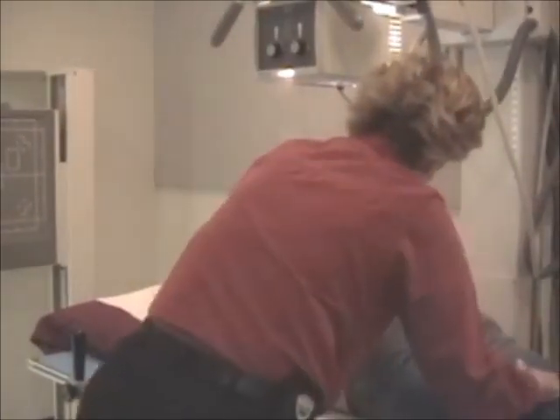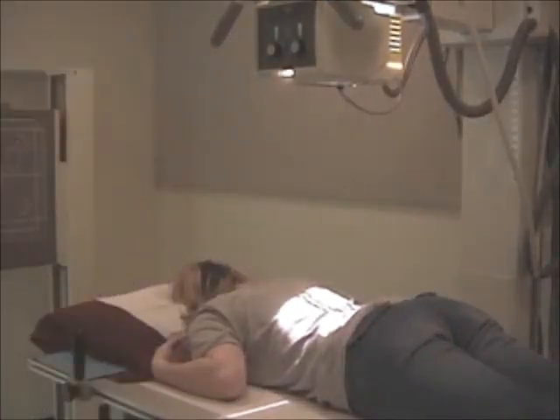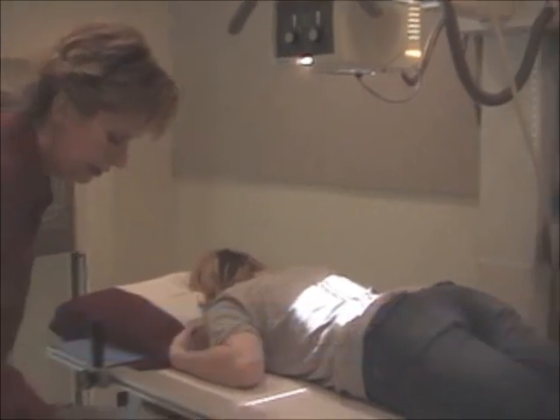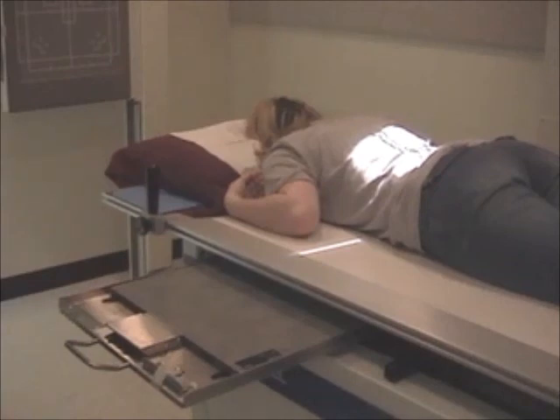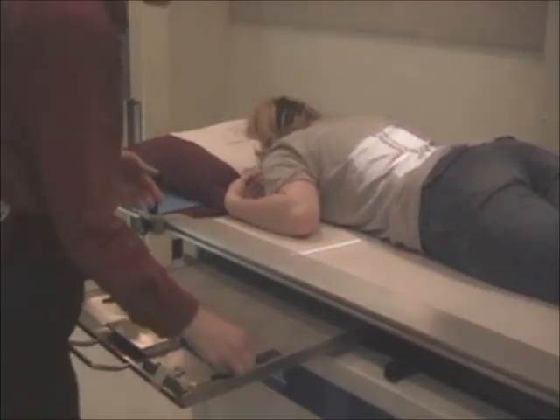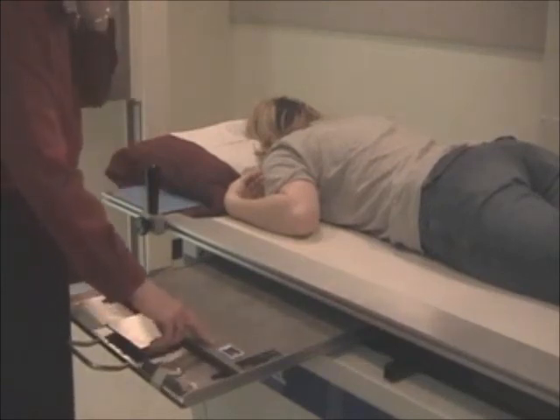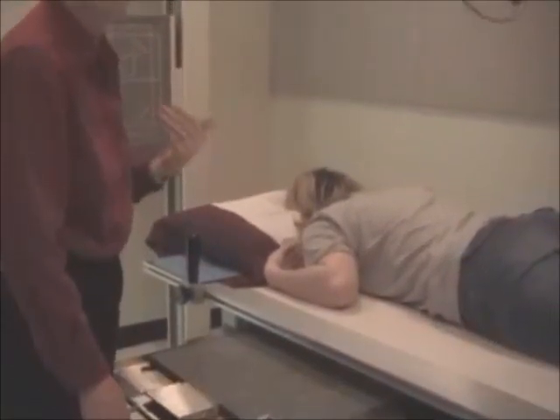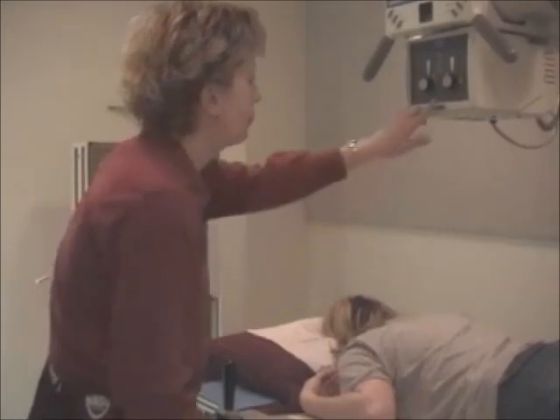Okay, so big film, we're going to put her MSP to the center of the film. I'm going to get her straight on the table. 14/17 cassette. The big films, you use markers. Little films, just initials. And I would actually mark how many minutes this was. I would have a 15-minute marker, say, here as well. In the lab here, we don't have those markers, but in the hospitals you will. So a 15-minute marker here might be half an hour, could be 45 minutes, could be an hour. Whatever the time frame was, that's what you'll put on your cassette.